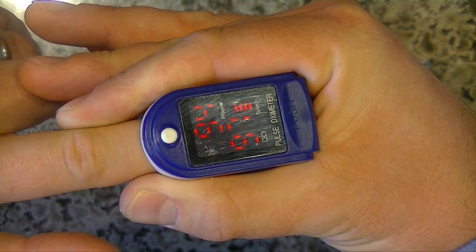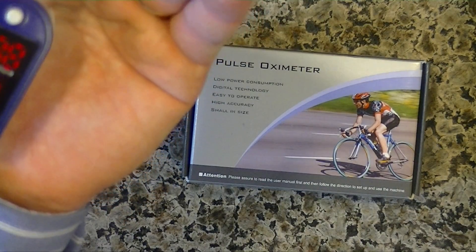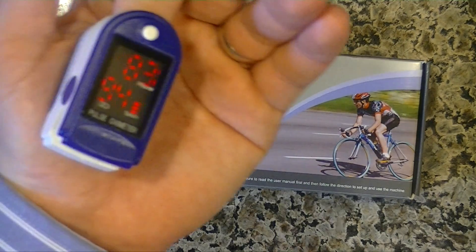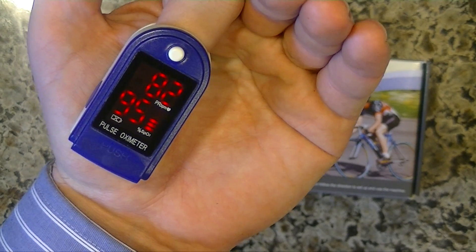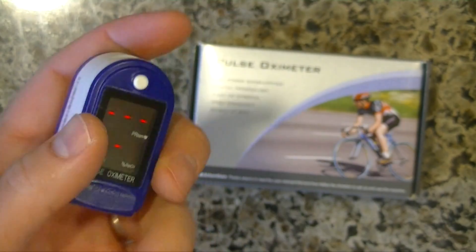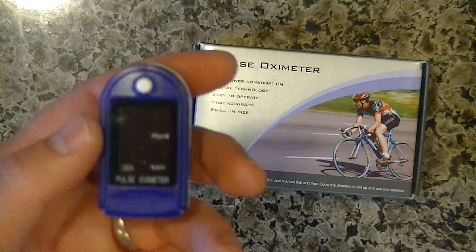You can see my pulse going up and down. Oh, I read that upside down, didn't I? 91 pulse and 94 — sorry, 95 blood oxygen and 82 pulse. So when you first put it on, sometimes it takes a while, but anyway, it was just as accurate as the one at the doctor's office.